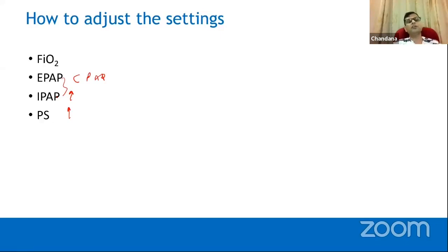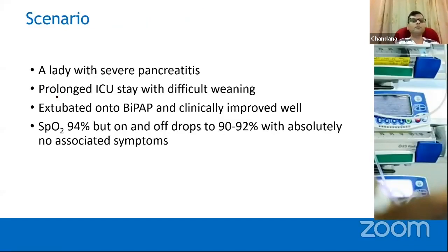So when you want to increase oxygen, there are two main things. There are so many things, but with the ventilator, the FiO2 and the EPAP or the CPAP. But of course, clearing out secretions, physiotherapy, positioning, if the patient is hunched over, you can actually position, there are so many things. But with regard to the mechanics of this NIV, the FiO2 and the EPAP are the two main settings you can change. So always look at the patient. The machine is not the priority. Look at the patient, what is happening to the patient. That is what you should actually practice.